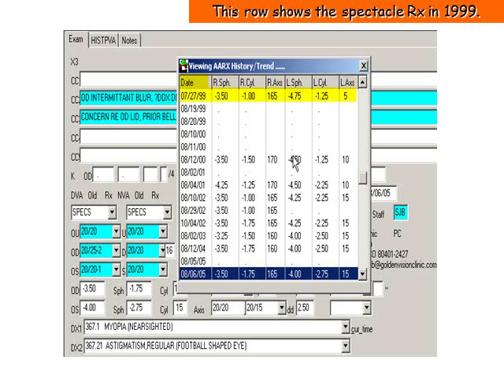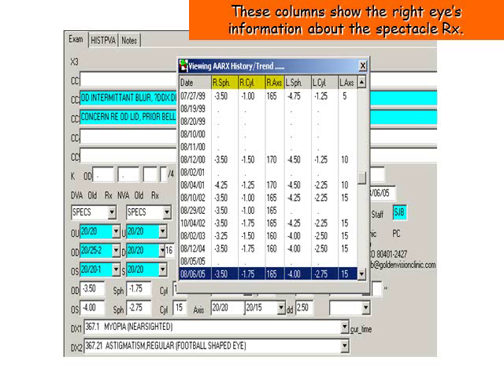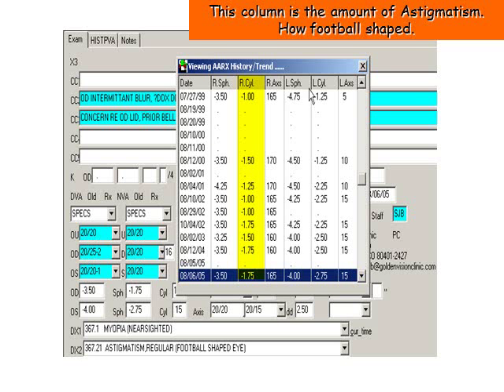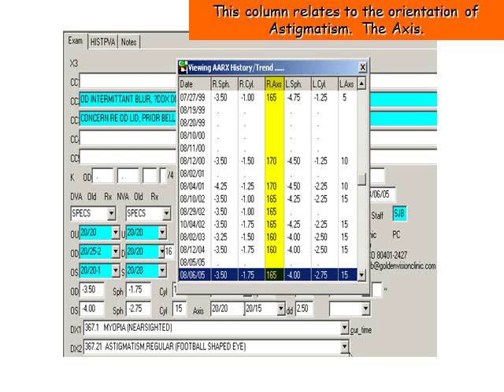Here you see a row that shows the Spectacle RX in 1999. This shows the Spectacle RX in 2001. Here we see the columns that show the right eye's information about the Spectacle RX. This column shows the change over time of the nearsightedness or farsightedness. This column represents the amount of astigmatism — how football-shaped. This column relates to the orientation of astigmatism, the axis.